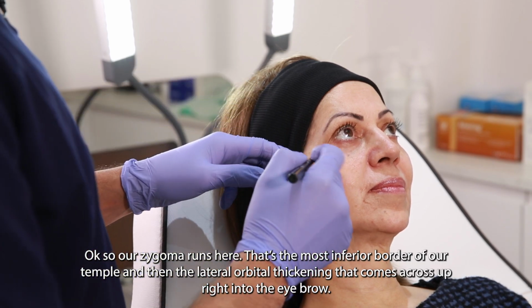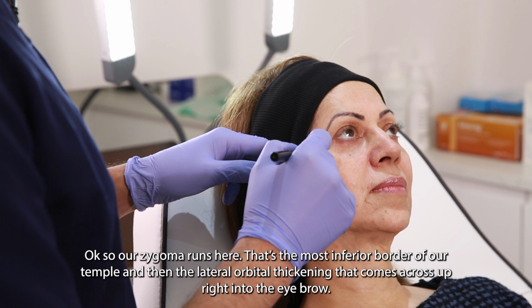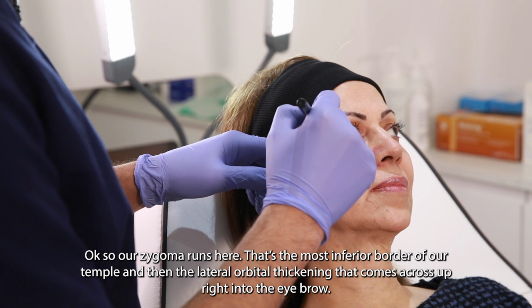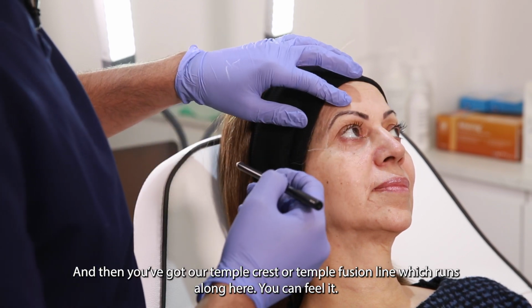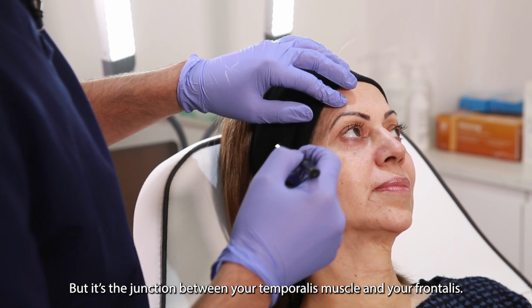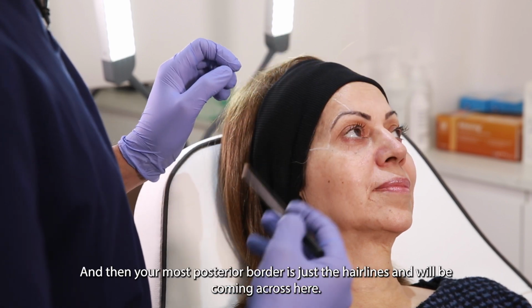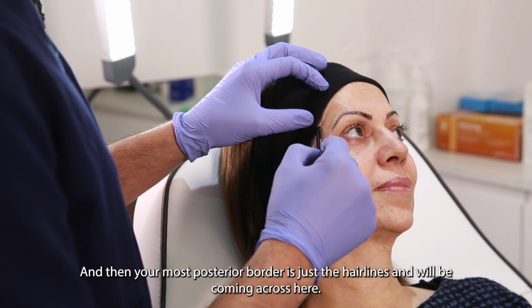Okay, so our zygoma runs here. That's the most inferior border of our temple. And then the lateral orbital thickening, that comes across up around the eyebrow, and then you've got our temple crest or temporal fusion line, which just runs along here. You can feel it, but it's the junction between your temporalis muscle and your frontalis, and that typically runs there. And then your most posterior border is just the hairline, so we'll be coming across here.